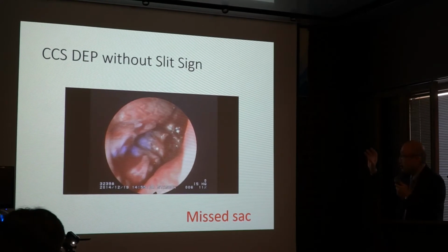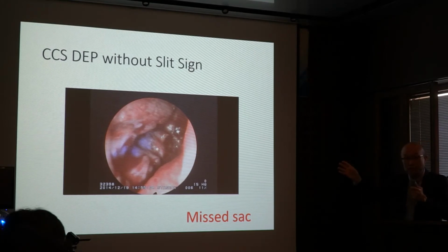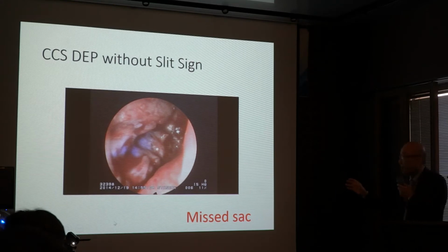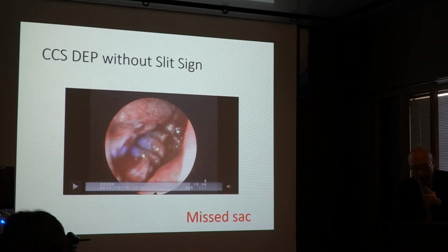Pre-op diagnosis was common canalicular stenosis. So the lacrimal sac lumen was stained by fluorescent dye coming from the stenosis portion. So we can see the stained lacrimal sac mucosa like this.